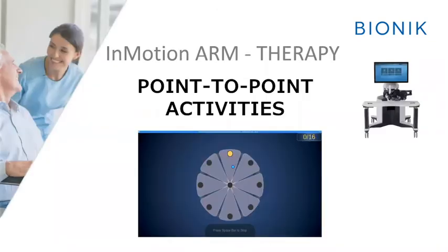So once the therapist analyzes the evaluation, he or she can then determine the best course of action for therapy using the InMotion system. Because the reporting is instantaneous, this can be done within the first session. And the therapist can use the report on the screen as part of the education of the patient as to the deficits present, depending upon the patient's cognitive status.